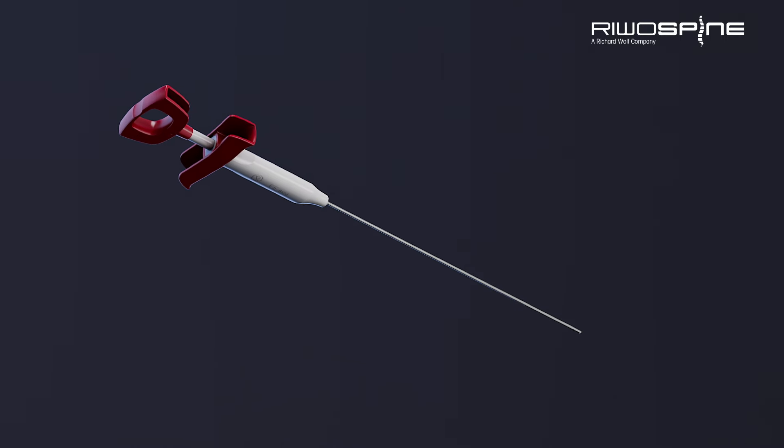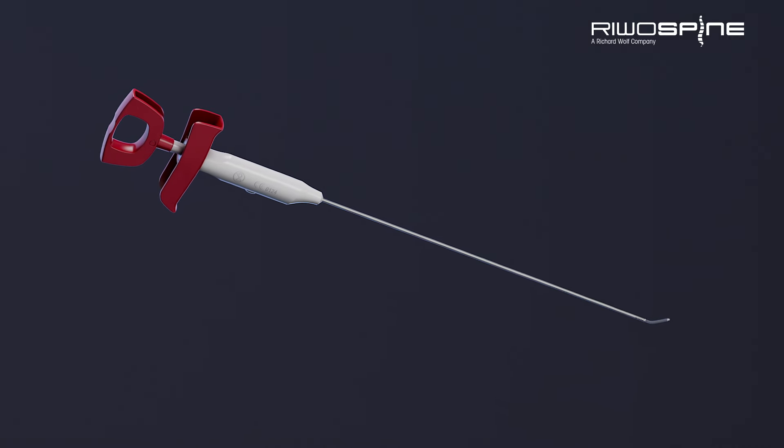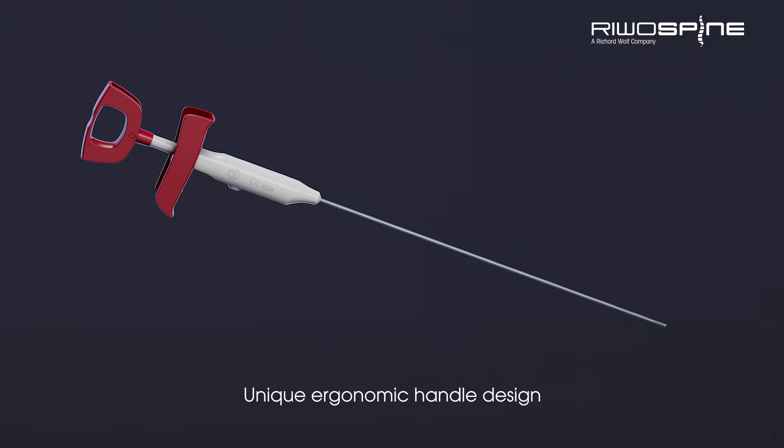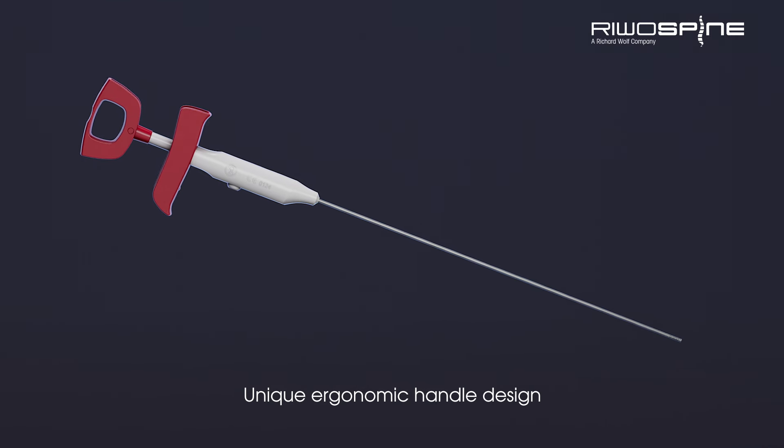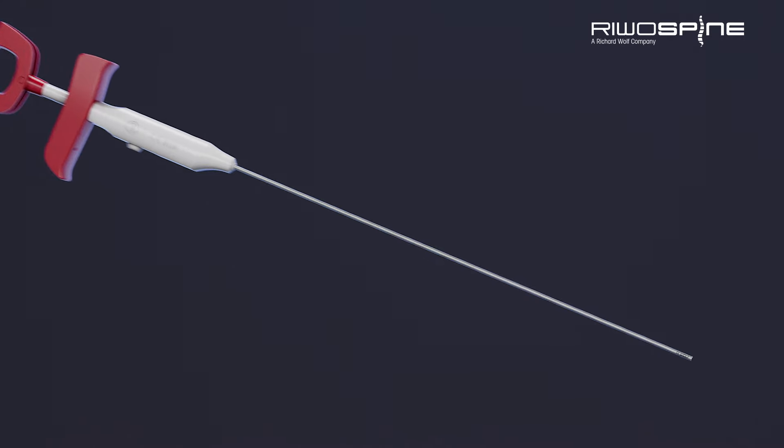Unique instruments are essential for effective and precise surgical procedures. Tip control electrodes are designed for all endoscopic procedures in spine surgery for focused application of 4 MHz radiofrequency technology.